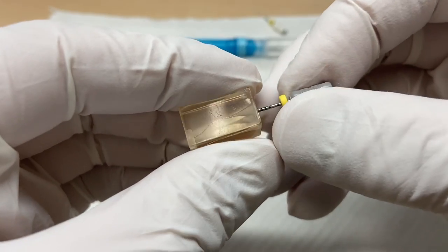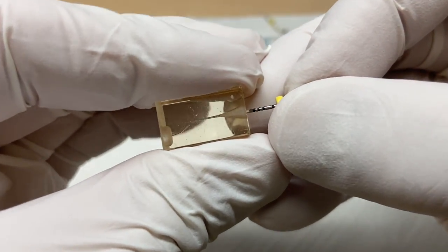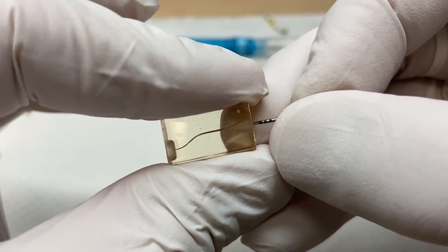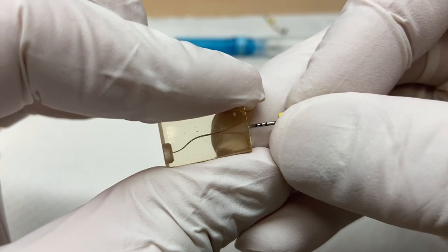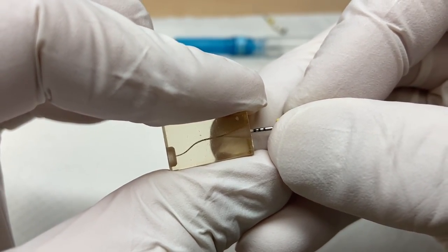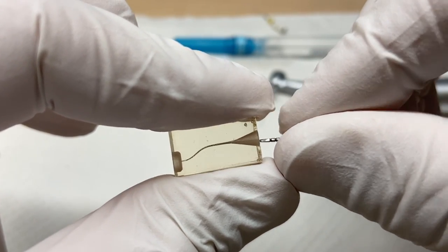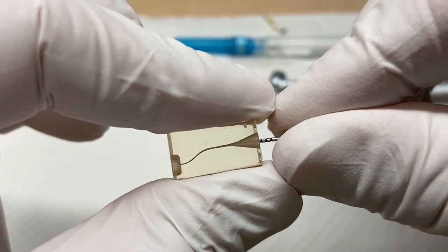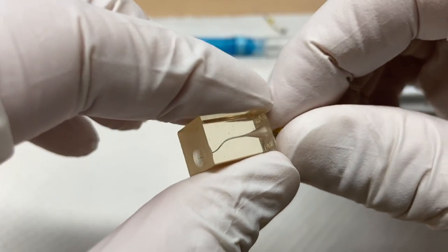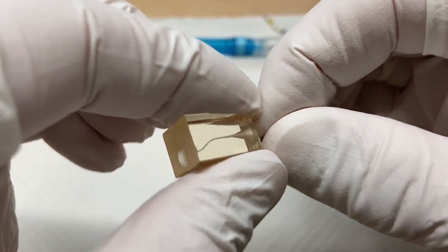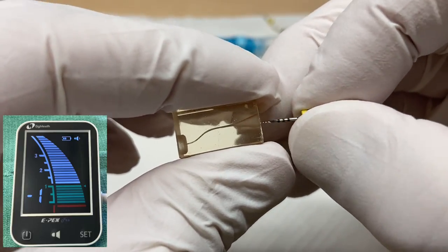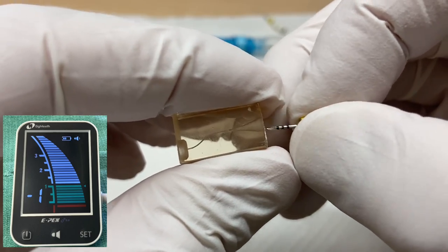And we're going to watch wind, pull. Now this is one way to do it. This is the way I do it all the time. It's going to be watch wind, pull. And then what we do is we're going to do some smoothies. Just like this. We call them smoothies. Just to create a smooth glide path. And we're consistent. We're keeping the flow. I mean, this is pretty straightforward. Everyone can do this. We're maintaining the flow of the canal. If only endo was this simple. I'm going out just a little bit out the end. Maybe one red bar. And there we go.